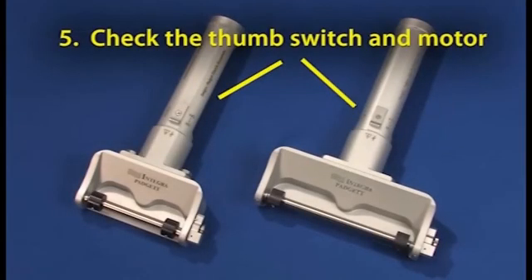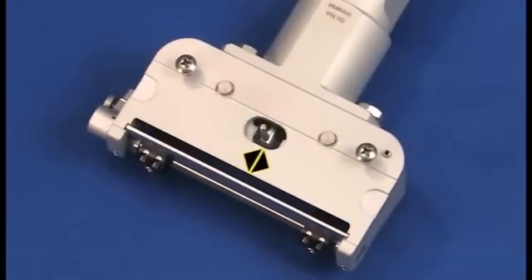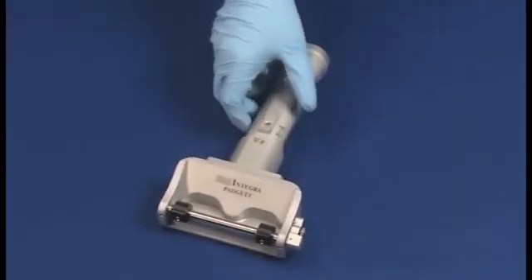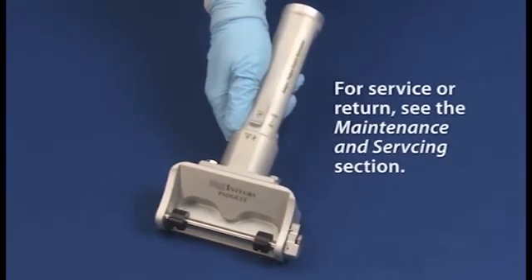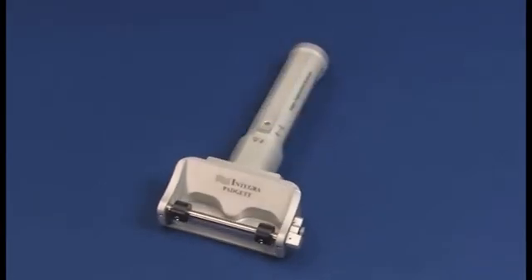5. Depress the thumb switch on the dermatome handpiece momentarily. The dermatome motor is to run, and the oscillating pin is to move rapidly from side to side. Note any unusual motor sounds. If issues are experienced with any of these system checks, do not use the dermatome, and return the unit to the Integra Padgett Dermatome Service Center for service. If no issues are observed during this assessment but performance issues are experienced, refer to the following troubleshooting table.